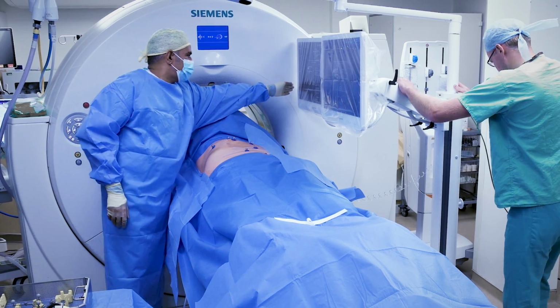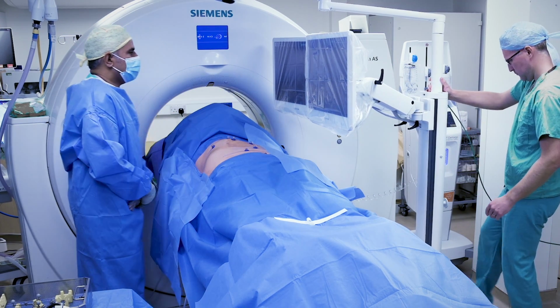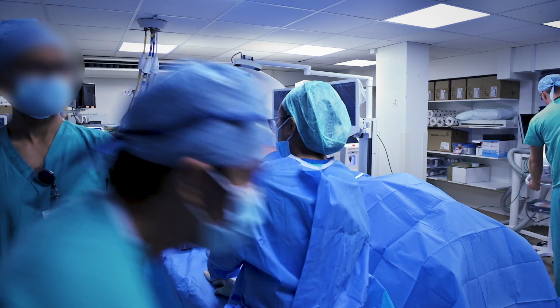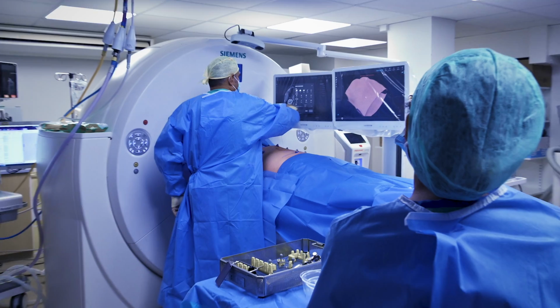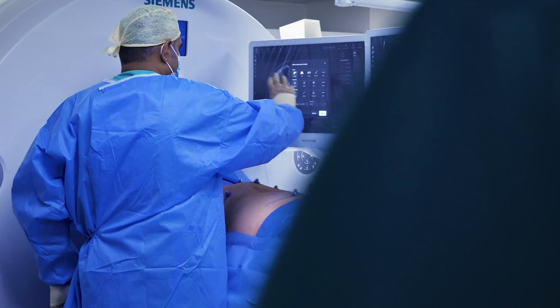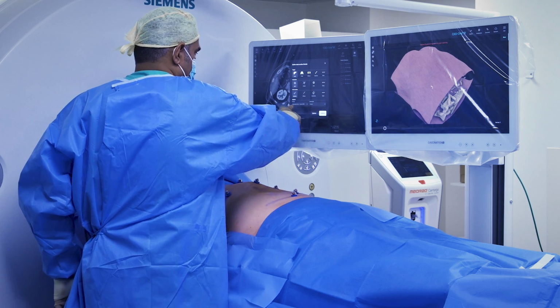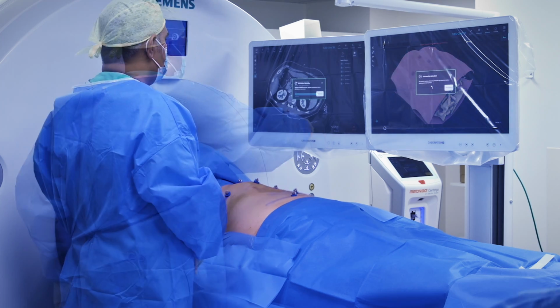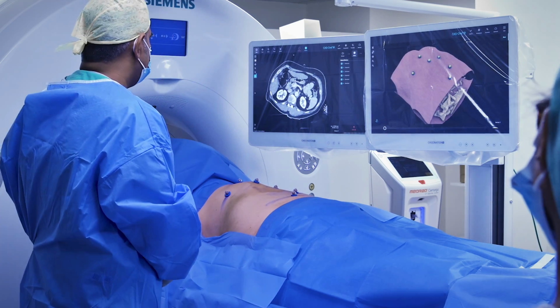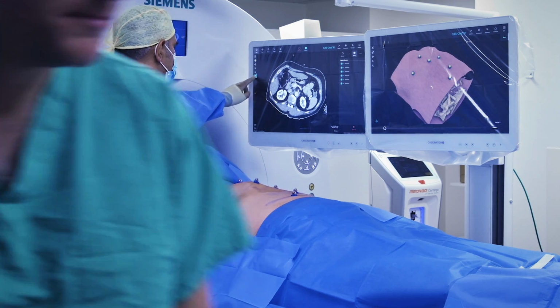The first thing we have to do here is load in the patient's CT scan so we can see what it is we're dealing with. We have the facility now just to specify exactly what it is we're doing. We've put liver, HCC and ablation. We're going to use the angiodynamic Solero probe. By defining that, it means in the background the segmentation process will now proceed, and that's indicated by the flashing light that we see here on the left of screen.